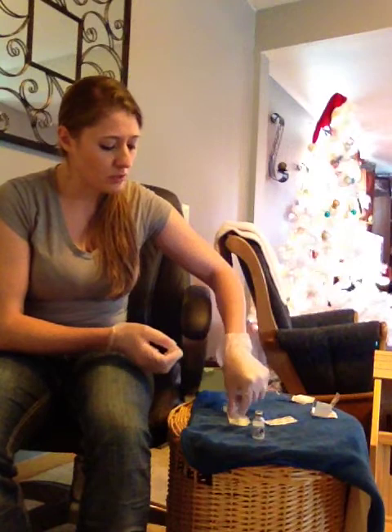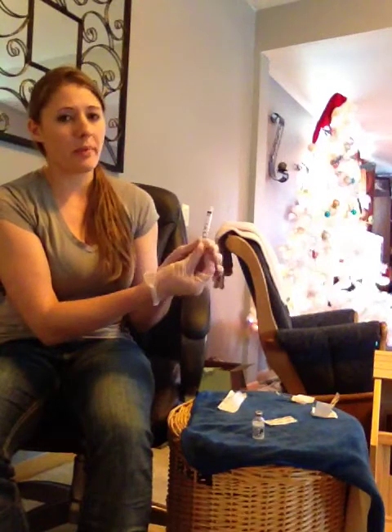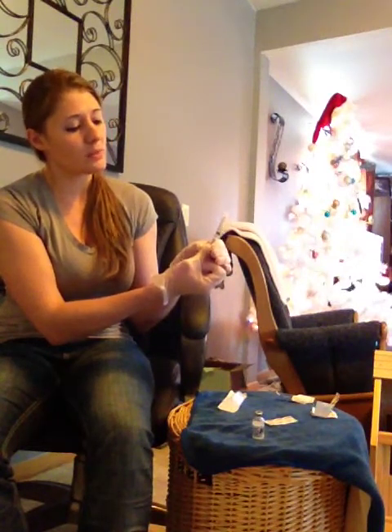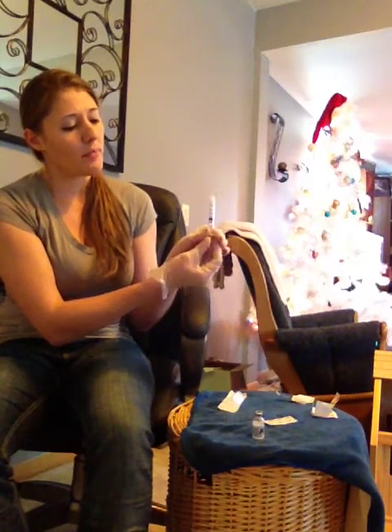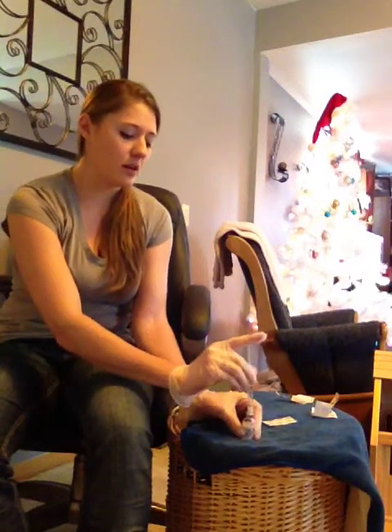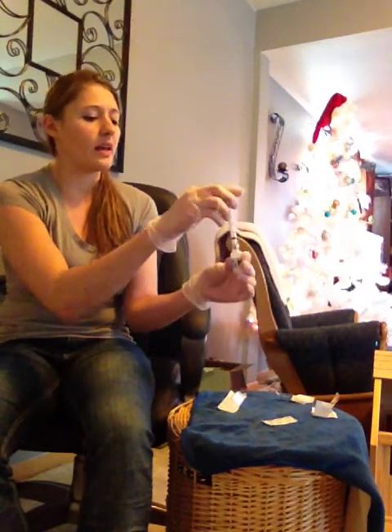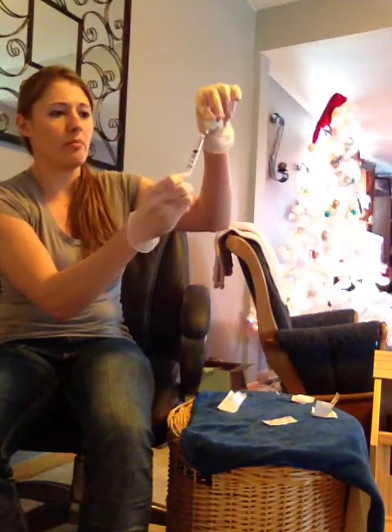So the next thing that we're going to want to do is open up our syringe and prep our needle. And we would have a needle on this already. Many injections actually come preloaded. So what we're going to do with this, since we're going to load our own, is load about 2 or 2.2 mils of air into this syringe. And then we're going to pump this air into our vial, like so. Pump the air into the vial. And then we will draw back our solution from the vial into our syringe.